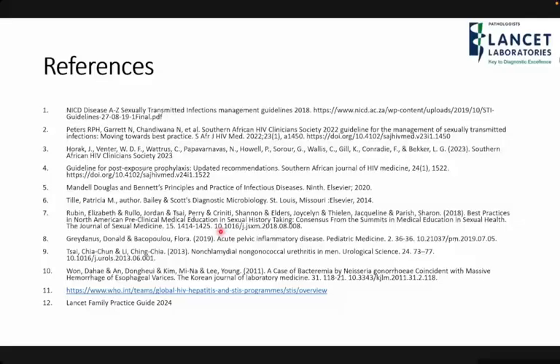If you use a dry swab, those organisms die. But the dry swab is fine for molecular tests because we're only looking for the genetic material, so whether the organism is viable or not doesn't really matter. The reason we can't use the gel swab for your molecular assays is because those gel swabs have inhibitors, and the results are invalid or come back as false negatives because of inhibitors in the gel.